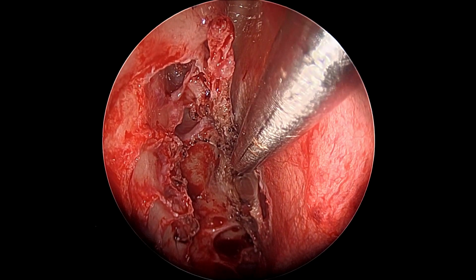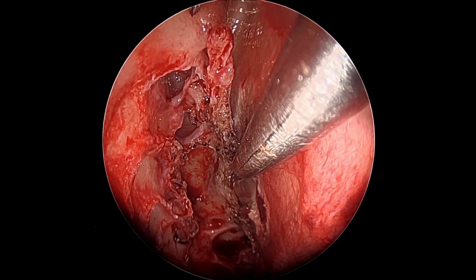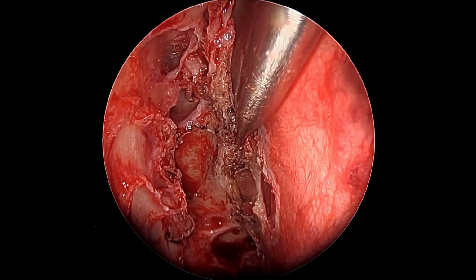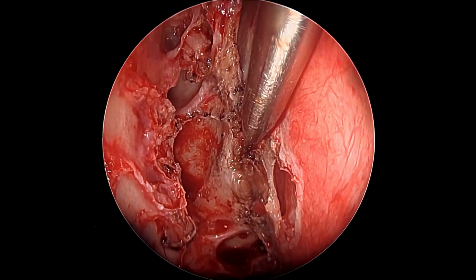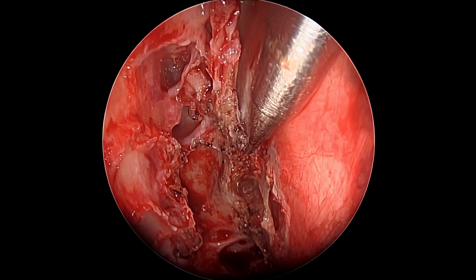This is our navigation probe pointing towards the skull base defect, which sometimes, again, like I said, can get obscured when we have been ablating it or coagulating it a lot. We can see here the depression of the dura, and this is the defect that needs to be closed.